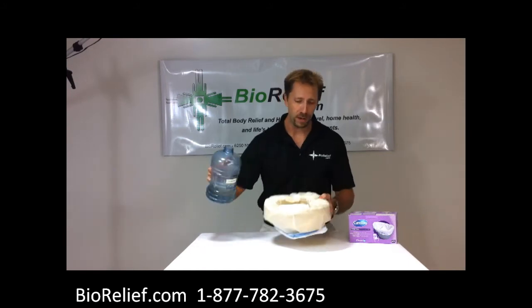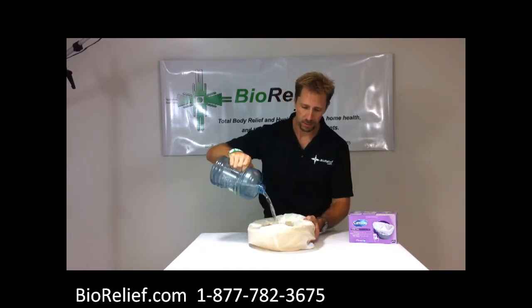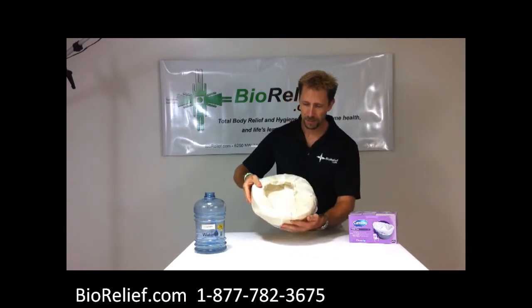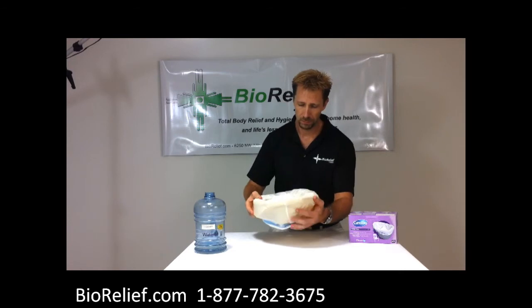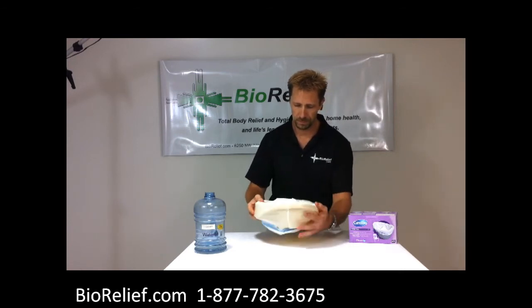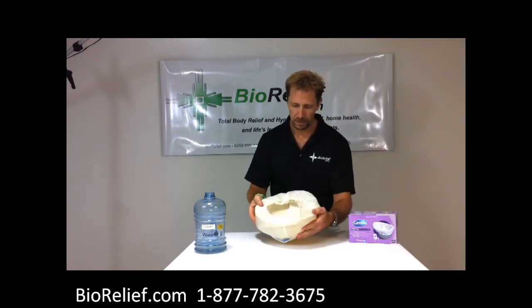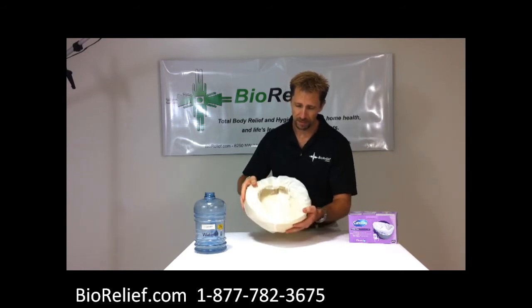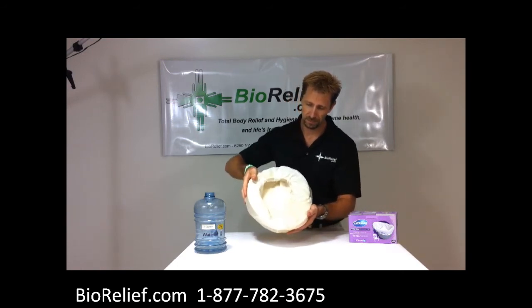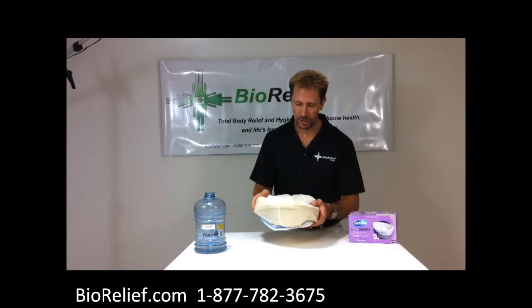As you can see here, I'm just going to pour some regular tap water in here. And you can see we're going to watch this happen — the water is just going to start to absorb into the towel. There's not much left in here as it is, and as you can see, it's almost solidified it.